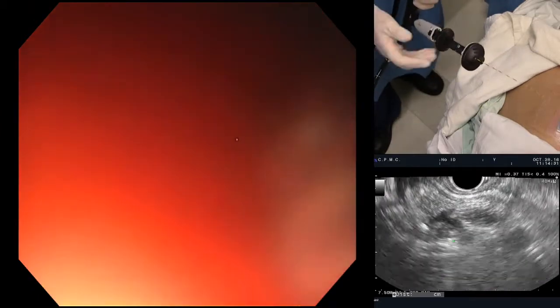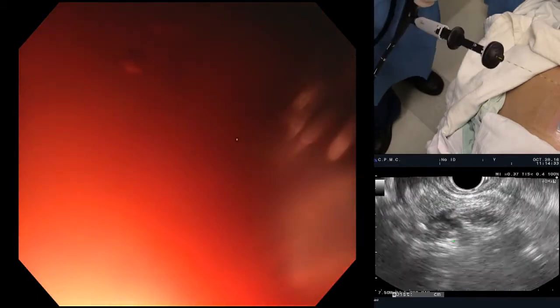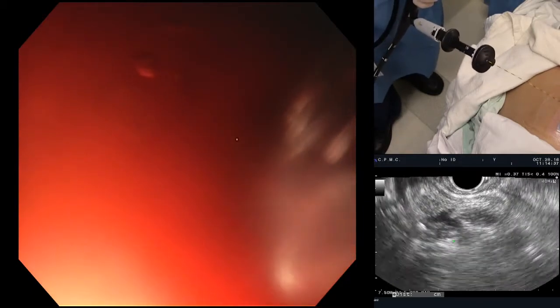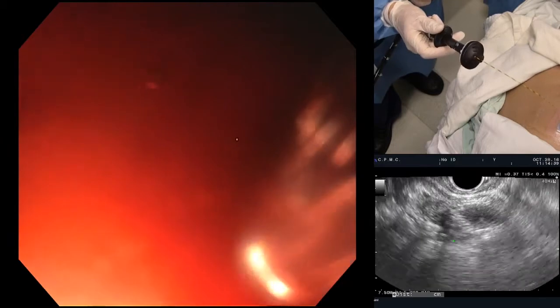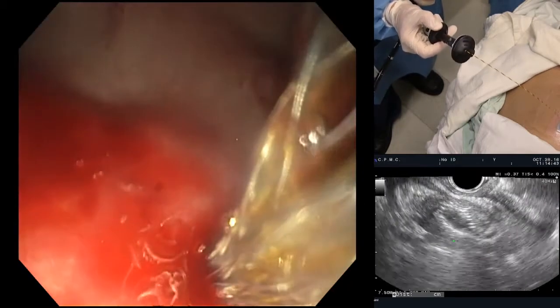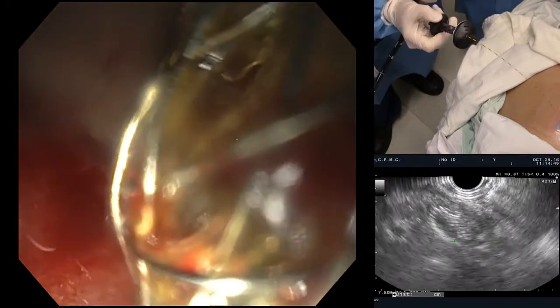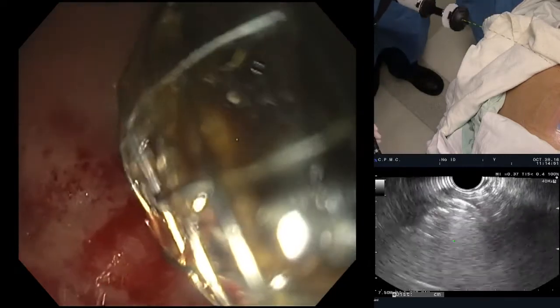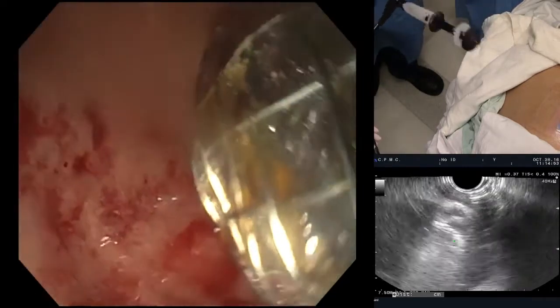So let's give a little bit of air. Our CO2 is on, correct? And on the screen on the right, you can see the nitinol wires, right? And I'm going to give a little air and push it out. See, I'm pushing it out, and then it's going to pop open. It's just about to pop open. There, it just popped open, and I'm going to give a little bit more air and pull away a little bit just to let it release completely.